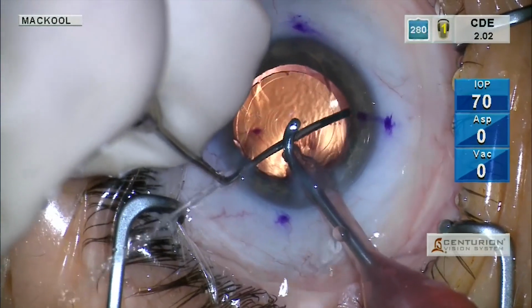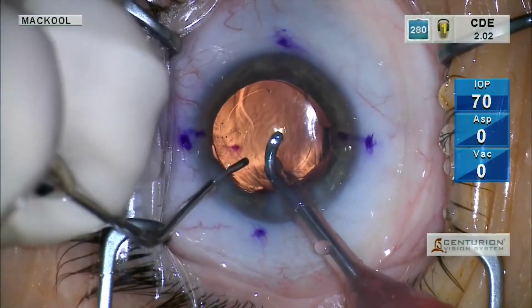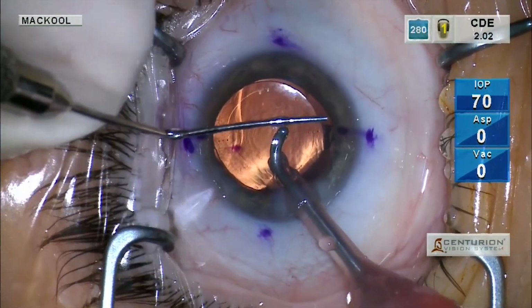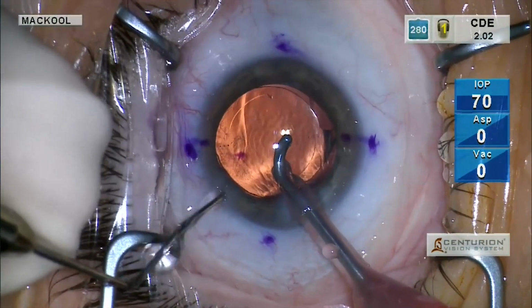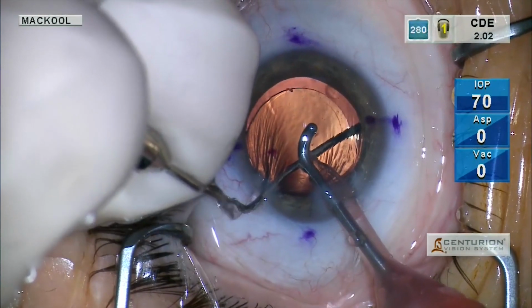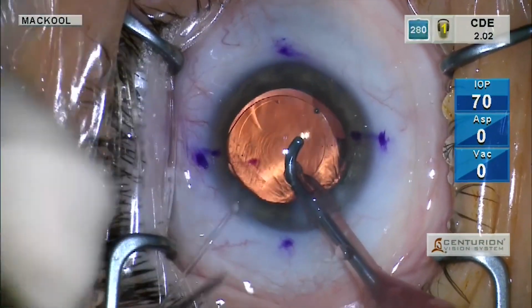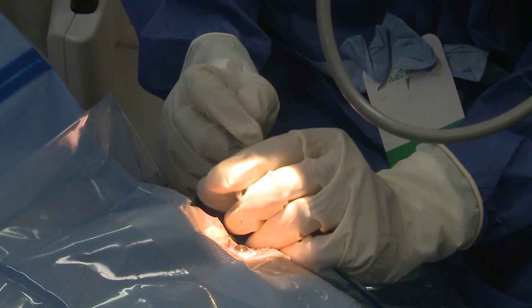And a little advanced, but worth mentioning, if you can't get the marks right on the corneal marks, leave them parallel to it. And here we're almost perfectly on them. I think we rotated another degree or two really, and that's it. There we go. Okay, so now it remains for us to do stromal hydration.